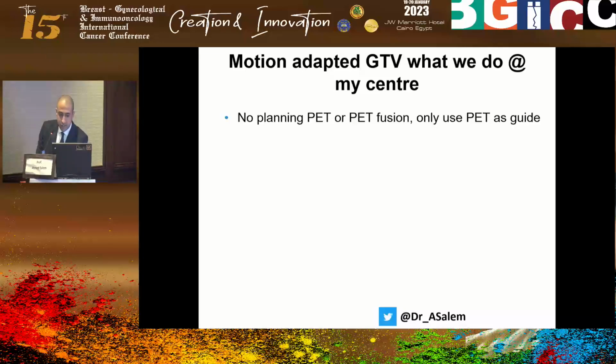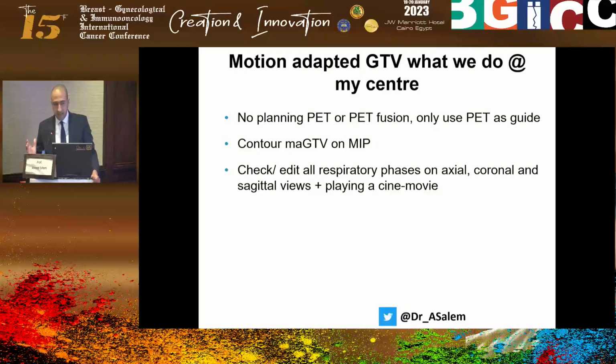So what we do in my institution: we don't have any planning PET. We don't even do PET for fusion. We only use PET as a guide, so we open it up on a different computer.